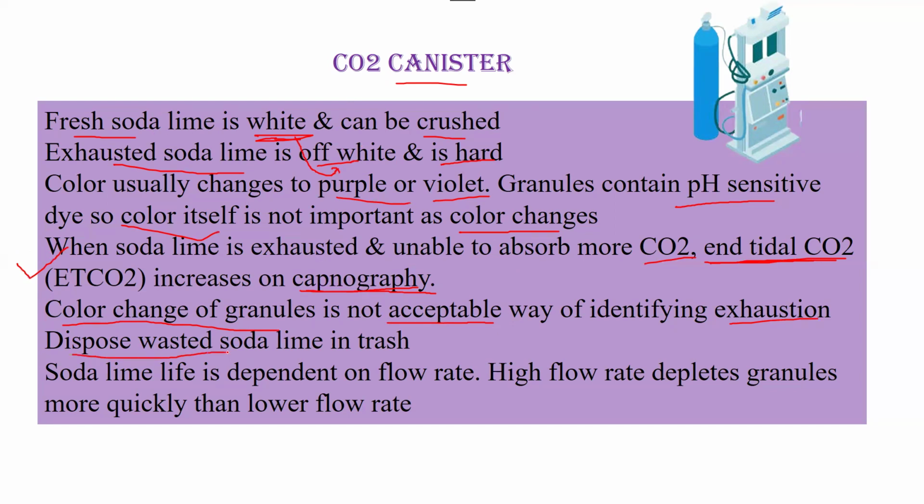Dispose the wasted or exhausted soda lime in the trash. Soda lime life is dependent on flow rate. If the flow rate is high, granules deplete more quickly. If the flow rate is lower, the granules will deplete slowly. So that was all about simple carbon dioxide canister or absorbers.